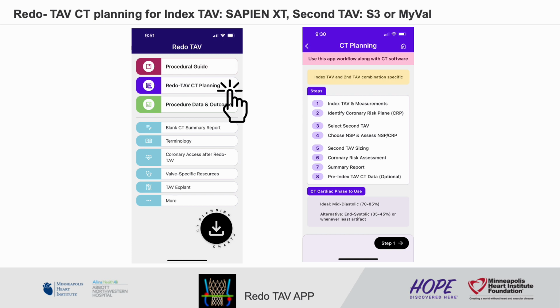you need to do. The CT acquisition protocol can be the same as the routine pre-TAV assessment. It's recommended to obtain an ECG-gated multiphasic functional CT that covers the entire cardiac cycle, ideally with 20 phases, a minimum of 10 phases. The mid-diastolic phase generally has fewer artifacts, allowing for better assessment of the prosthesis leaflet and commissure alignment in most patients. The end systolic or end diastolic phases could be used as alternatives.